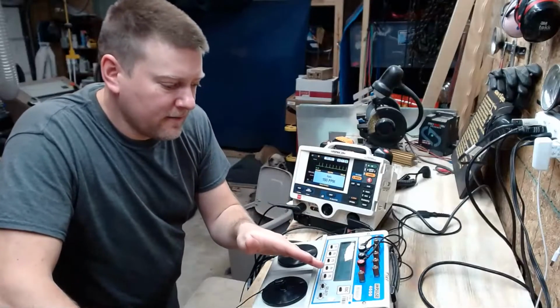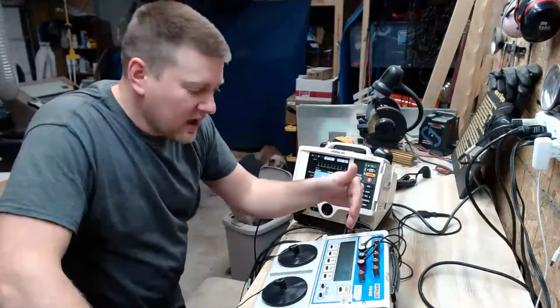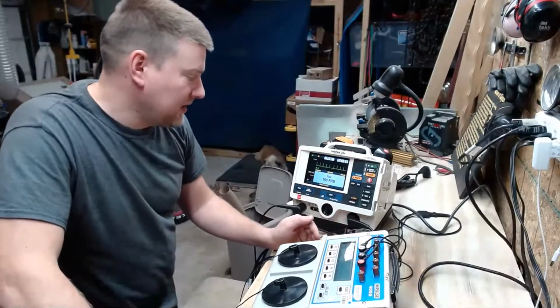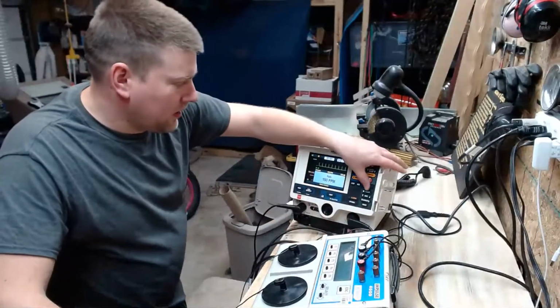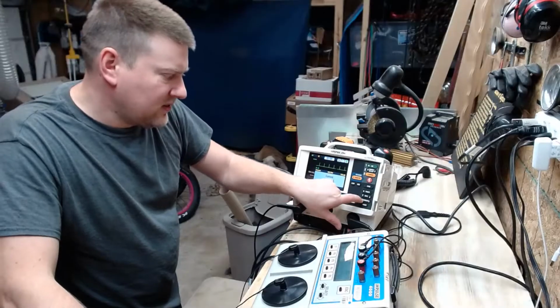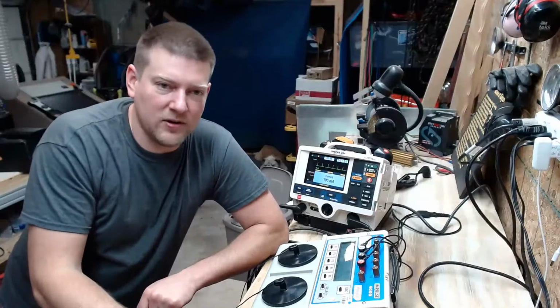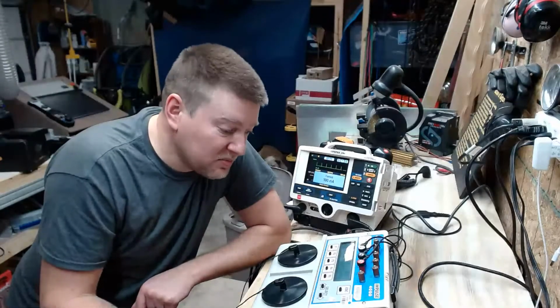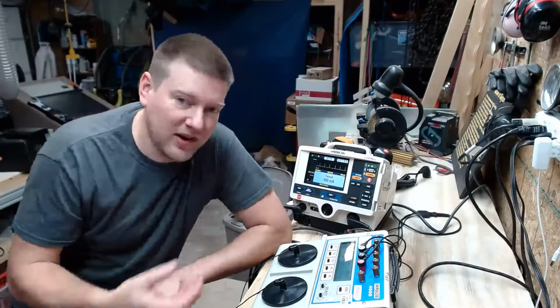Okay, I'm at 150 to 151 ppm, so I would document this as 151 ppm. And over on the amount of current, I have 153.6 milliamps. So I'm off by 3.6 milliamps. Let's take it down even further. I like doing things in 100 because that tells you in real percentage what your deviation is. So we're at 100 milliamps, 100 ppm. Over here, I'm at 100 ppm and I have 102.8 milliamps. So that means I'm off by 2.8%.